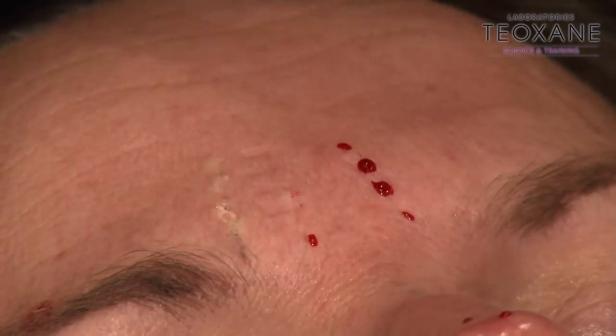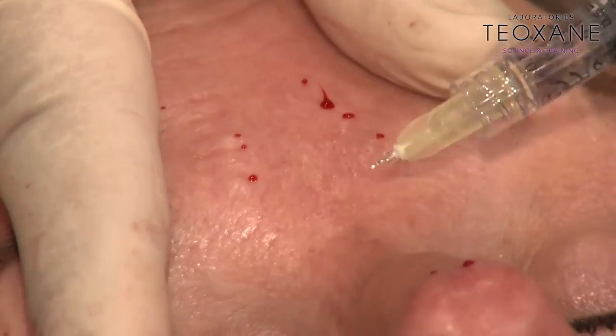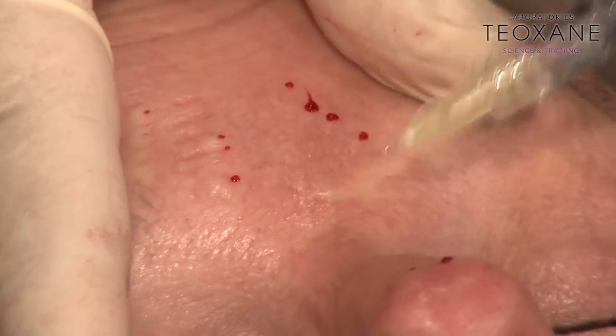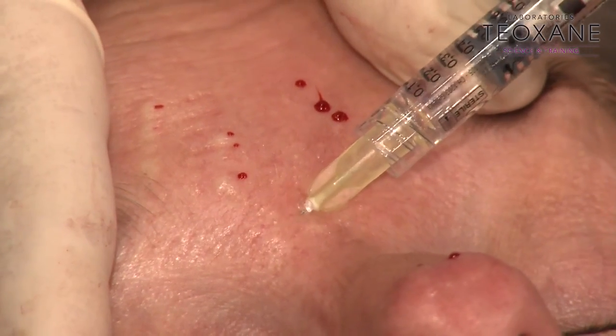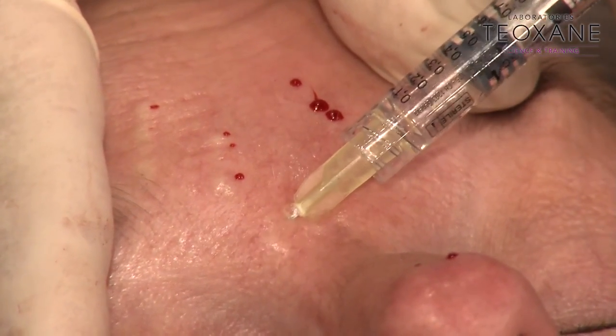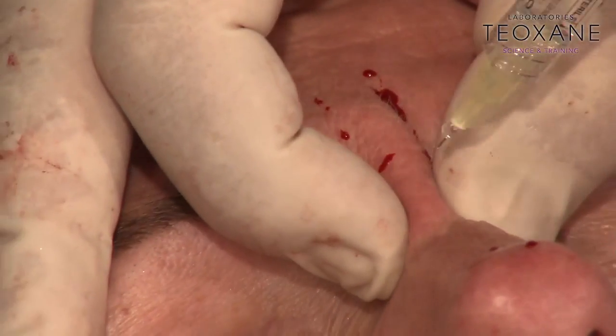Every day, when you have it in hand, you will see it flows. It blends perfectly with the skin. That's what we want. We want something to blend perfectly with the skin, so that when you finish the work and you spread it all, you can't feel it. You can't even feel you put some fillers. So this is nice. So here, I'm going to reduce, the angle is a bit too deep.